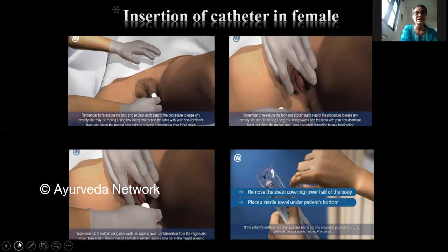You are going to do it in a front to back fashion. After you are done cleaning the patient, you are going to remove a little of the sheet from the perineal region, and you are going to use the lubricant jelly over the meatus of the patient.